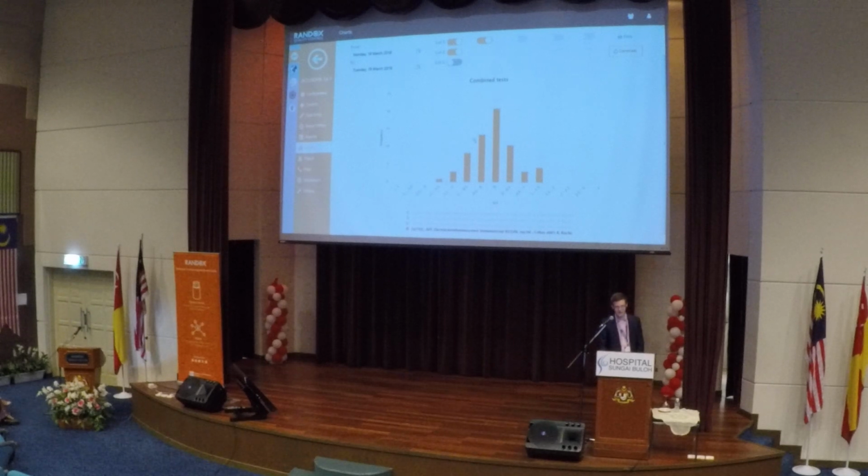Obviously, if our bars were very high in this range here, that would be cause for concern, especially if that same thing wasn't reflected on the other side. So our histogram charts are where we can identify potentially more long-term bias, whereas our Levey-Jennings charts are for evaluating day-by-day QC performance. So that's our orange test. Let's then look at our green test.